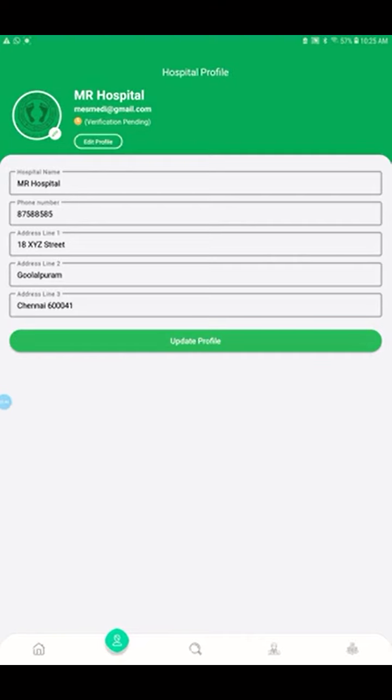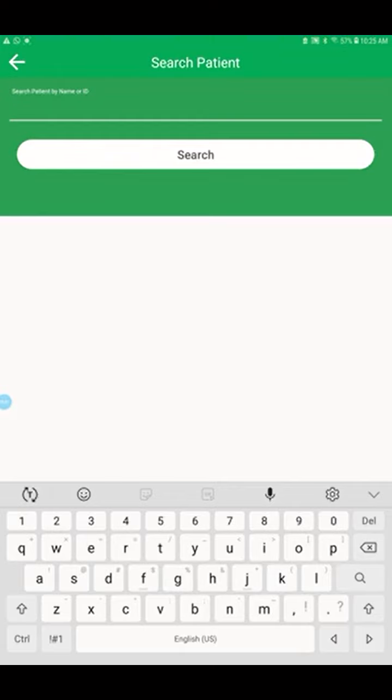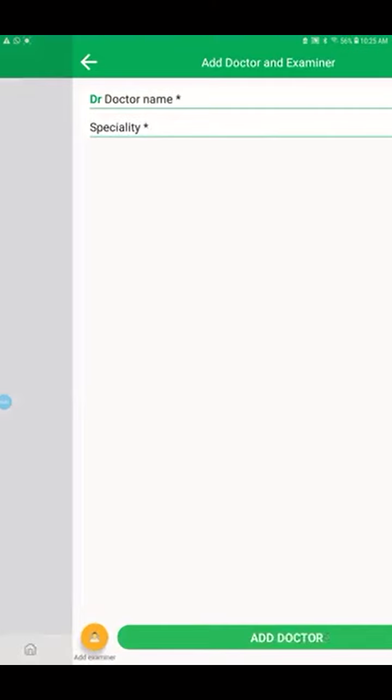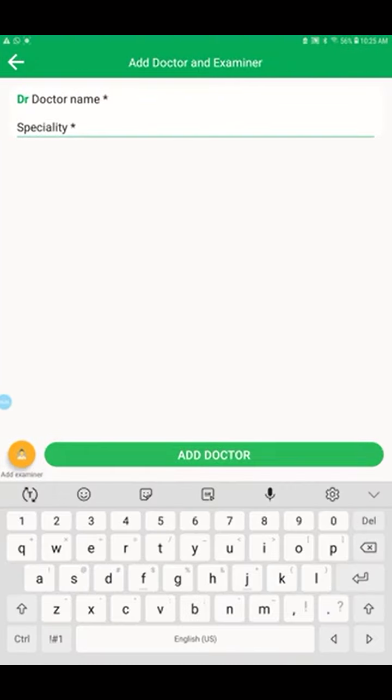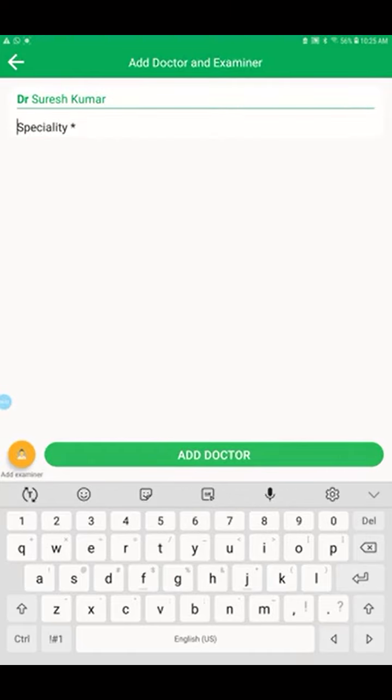And then in the center you have the search button. In case you have a lot of patients and you want to search a particular patient, you can search by name or by ID. And then next one is the consultant doctor's name. Okay, so add only the name, because doctor is already prefixed there. So you can type any specialty. I am saying diabetologist.